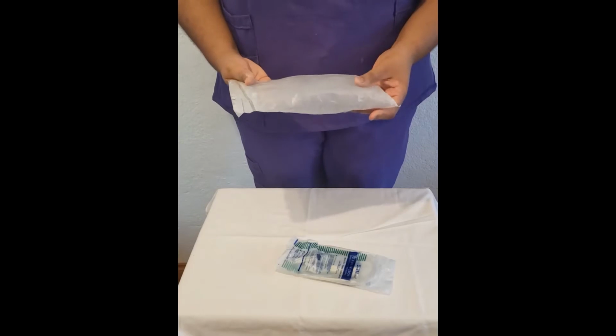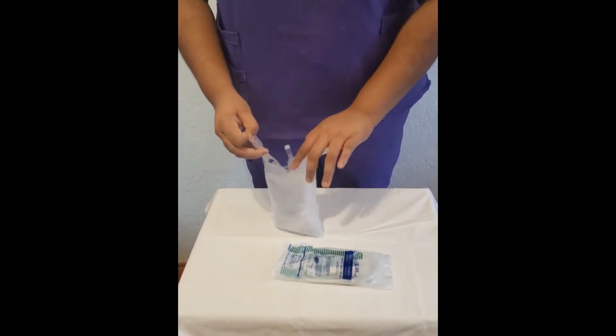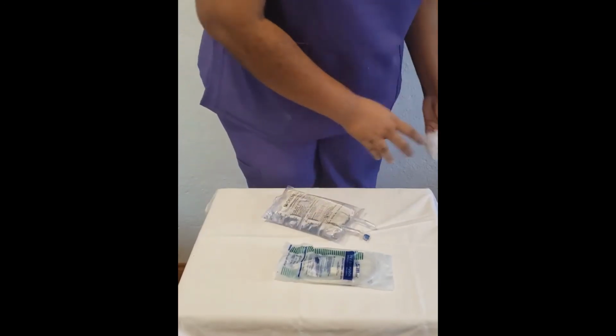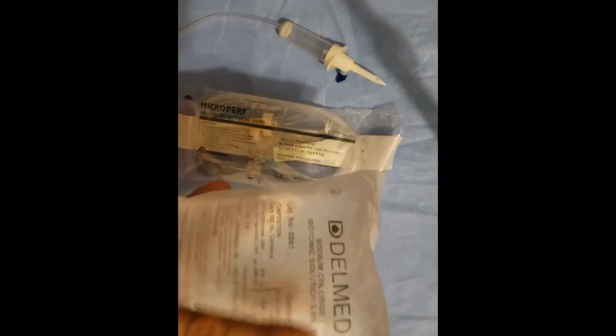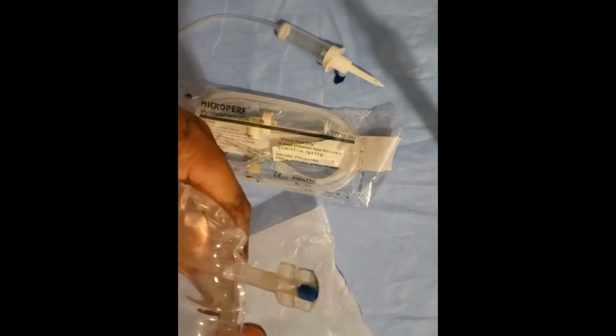Let's prepare the IV fluids for administration. The package for the IV fluids must be inspected that it is intact and within the expiry date. There is a pre-torn slit on the bag that aids in opening the package. You would have checked that the fluids you are preparing is what is ordered for the client and the volume of the bag is suitable.